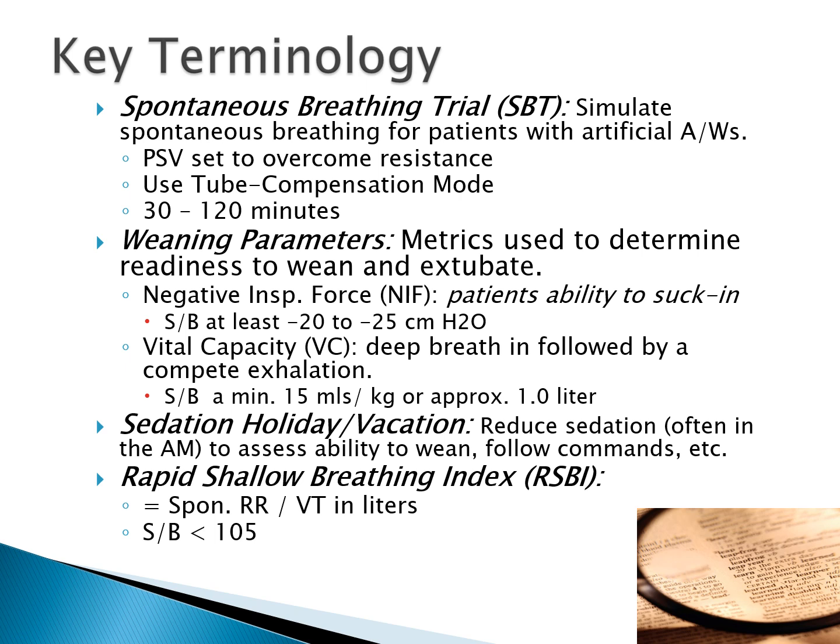There may also be some psychosocial things, like the patient may just be in better spirits because they can eat, they can speak, they can have better mouth care and things along those lines. But the main driver there is that the length of the trach tube is about 1/3 the length of the endotracheal tube.